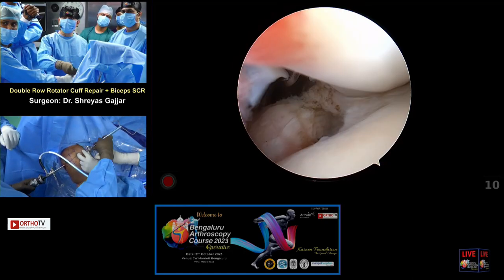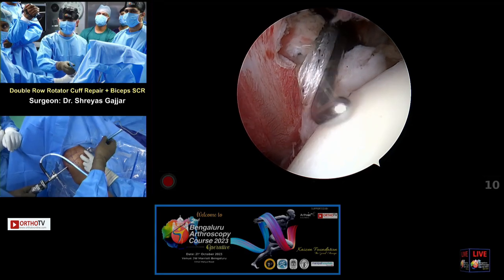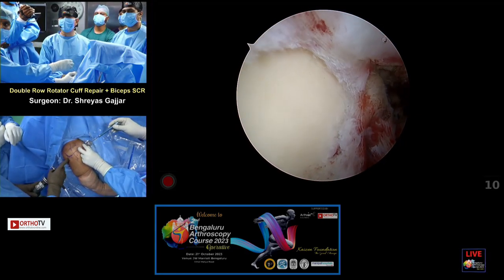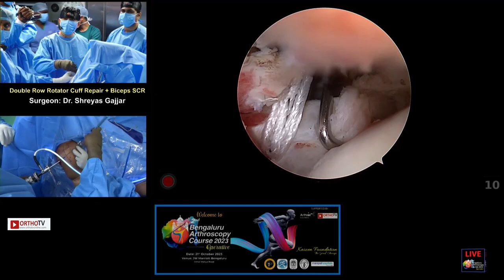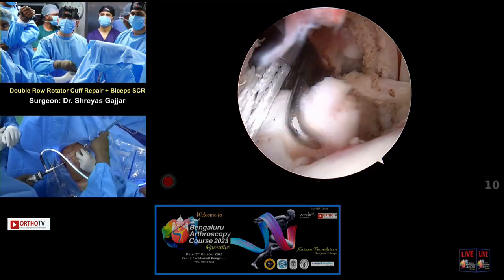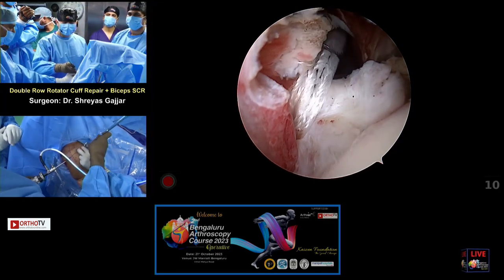So I'll talk you through a diagnostic round quickly. The biceps was fine. The superior labrum had just a little bit of fraying, so we have smoothened that. The glenohumeral joint is unremarkable. As I mentioned, there is a superficial tear of the upper third of the subscap, as you can see here, this part. So we are just going to repair it with a knotless anchor.